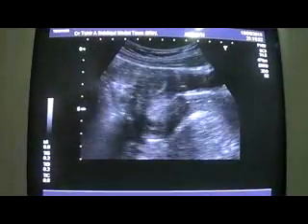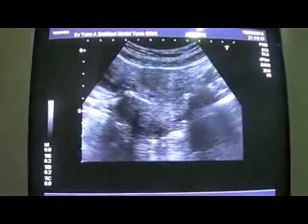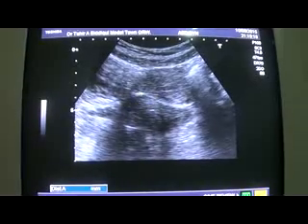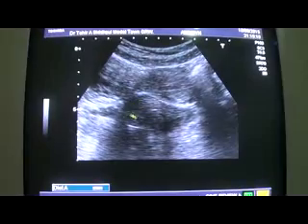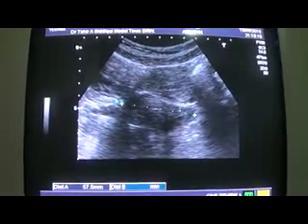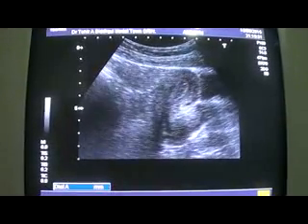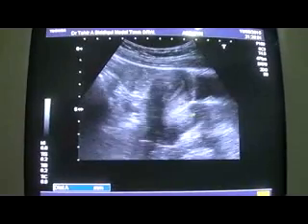Now one uterus is retroflexed, this one. This is the uterus that is almost retroflexed out. In this shape, see, this is the uterus, this one. Outer surface, posterior surface, endometrial canal, anterior myometrium, posterior myometrium. This is the cervix, and in this dimension it measures 5.7 centimeters by 2.5 centimeters. So this is uterus number 1: fundus of the uterus, anterior myometrium, posterior myometrium, cervix, vagina, fine.